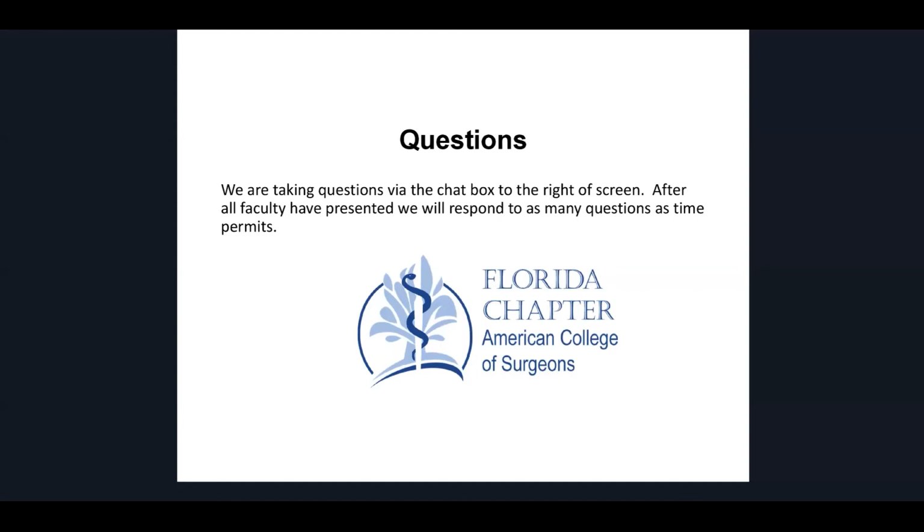I call it intensity modulated high intensity focused ultrasound. I haven't published it to coin it, but it's basically the idea that if you have a targeted lesion that you're going to do focal therapy on, you now have the lesion that you can target. Whether you do a focal therapy or even, let's say we're going to treat the whole prostate, you can potentially double treat the region of interest that your MRI targeted. So we can now really focus on that area, and with the MRI images, instead of guessing that it was that area, we can now target it.